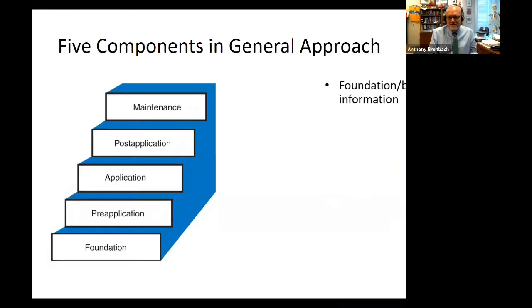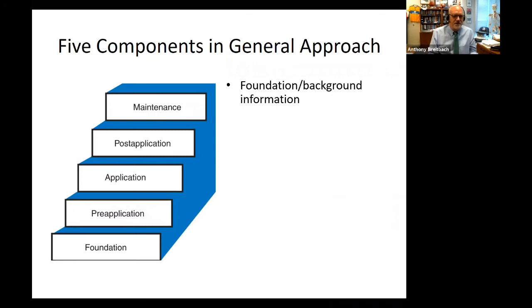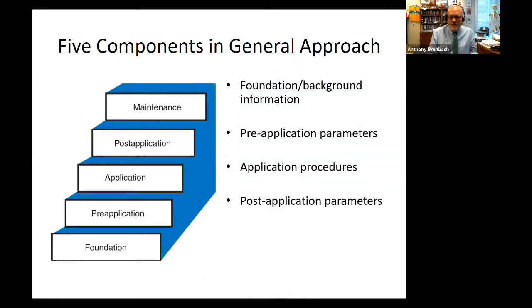So the 5-step process is, number one, you need to understand the foundation and background information. You need to understand the science behind whatever modality you're trying to use. You need to understand the steps you need to go through pre-application, how to safely apply it, the steps you need to go through post-application, and maintenance and how to maintain the equipment. Most of these things have equipment and they're fairly expensive. You need to understand how to manage that situation so you can continue to use it over and over and over again.